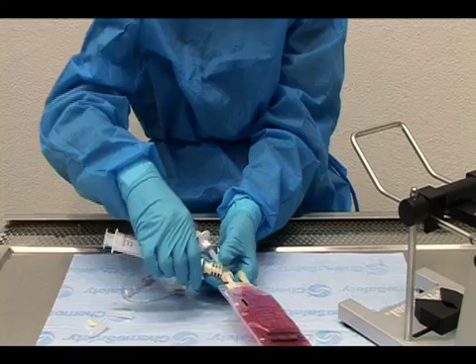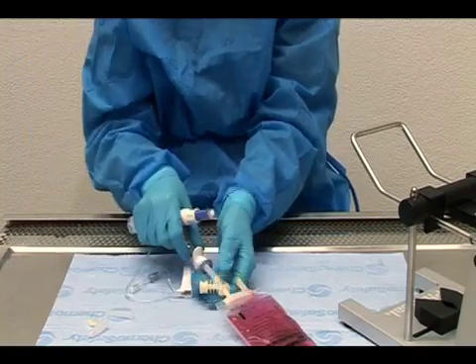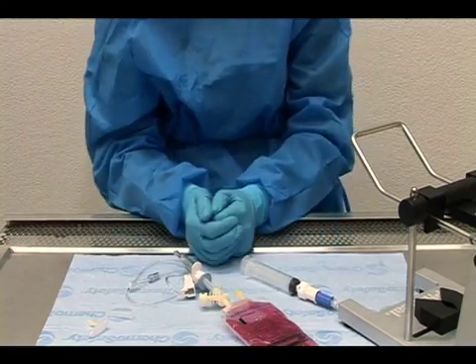Disconnect from the IV bag. The IV bag is now ready for infusion.